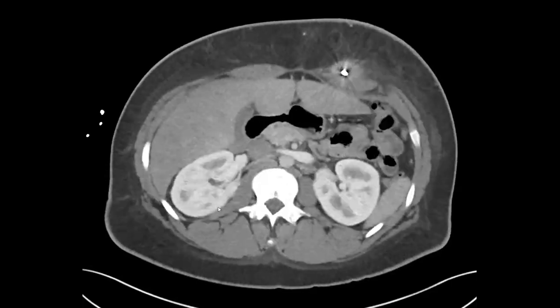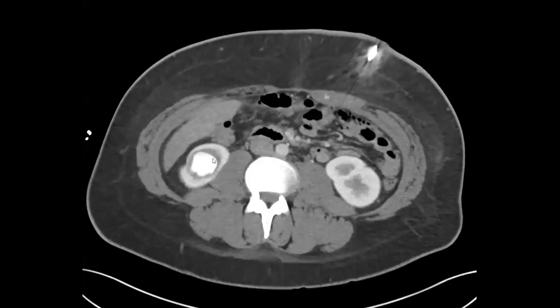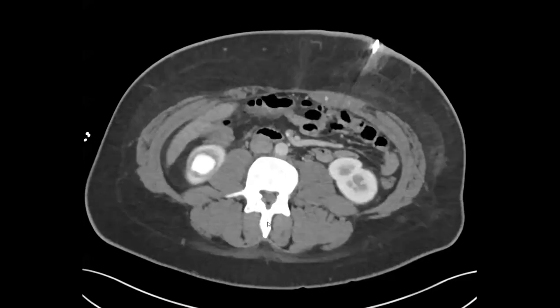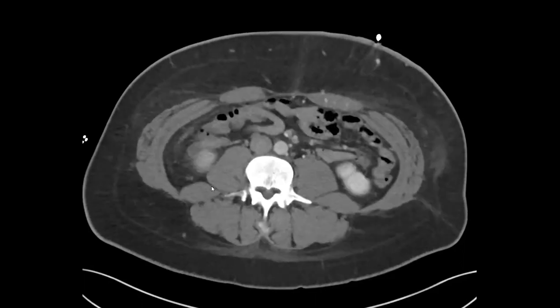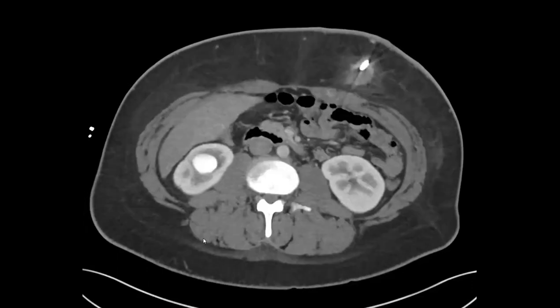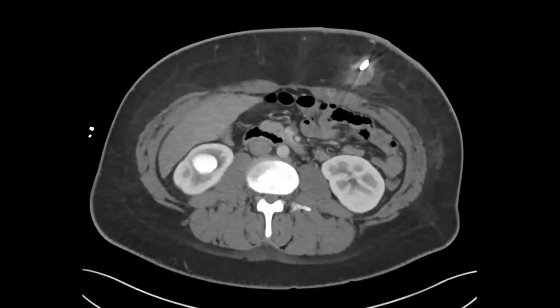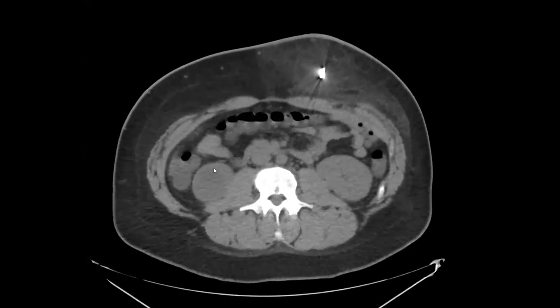If it was frank extravasation it would look more irregular. The first thought was a pseudoaneurysm — these typically occur after renal biopsy, but this patient had no renal biopsy. Someone mentioned calcification, which is always a good thought when something looks bright, but on a non-contrast scan from a month ago there was no calcification — the lesion was there but not dense.